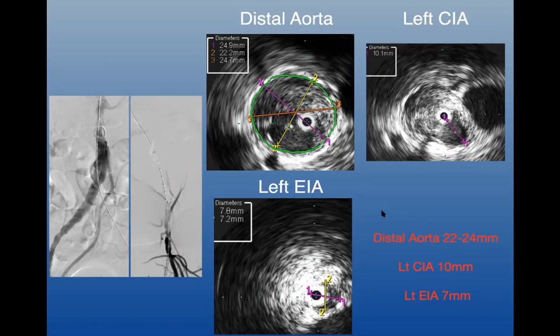And what I ended up doing in this case is I ran an aspiration catheter through it before I did anything. So I took a Penumbra and ran it two passes through there, to suck out any debris, any clot, anything that could go down the leg, as a precaution in this case. Or you can use a suction thrombectomy catheter or whatever you have in your lab. So once I did all that, I felt very comfortable. So what's the next step?